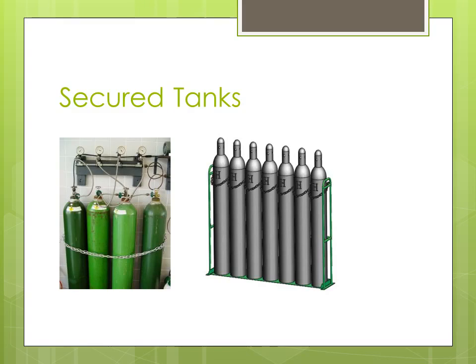Something else to keep in mind is when you're transporting tanks, there is a tendency to want to lay tanks down, like in the back of a van. Technically, you're not allowed to do that. You need to secure them in an upright position when you transport them. I think that's another common practice that people don't realize violates codes. So that's it for medical gas and our overview.